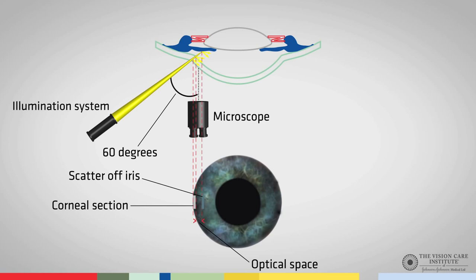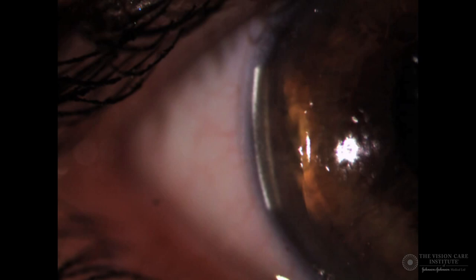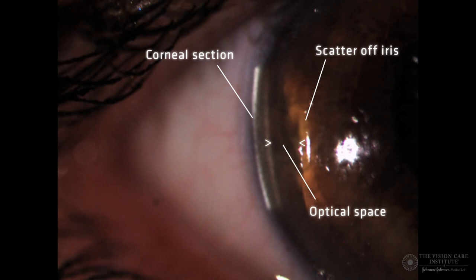The space between the corneal section and the iris scatter represents the aqueous. What we need to do now is compare the thickness of the corneal section to the space between the endothelium of the cornea and the leftmost side of the scatter off the iris. We can see this here on the image itself — the corneal section on the left and the scatter off the iris on the right. We now need to assess how thick the space is relative to the cornea.